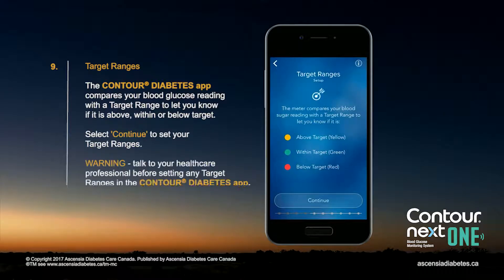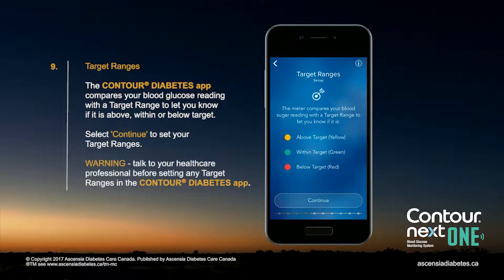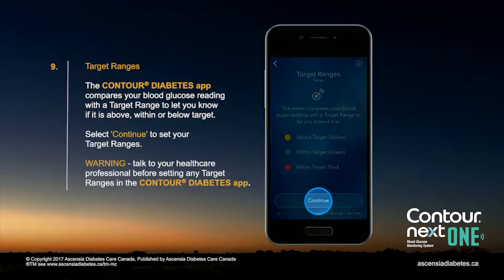The Contour Diabetes app compares your blood glucose reading with a target range to let you know if it is above, within, or below target. Select Continue to set your target ranges.